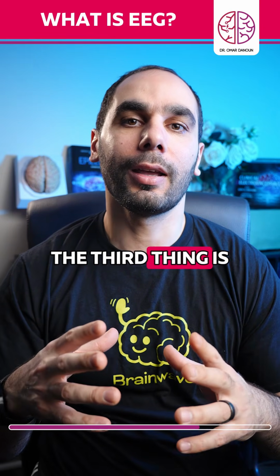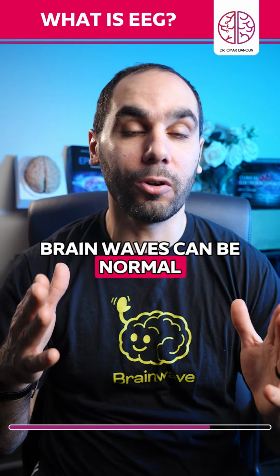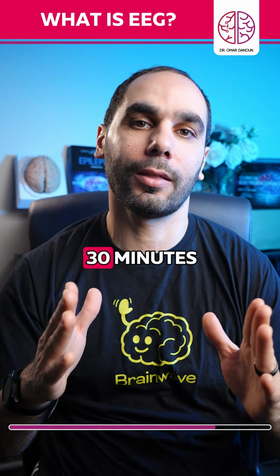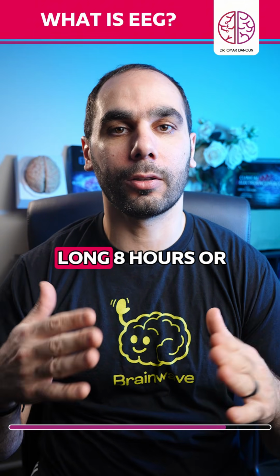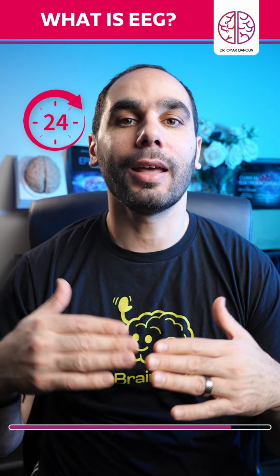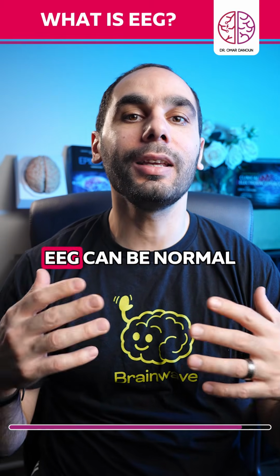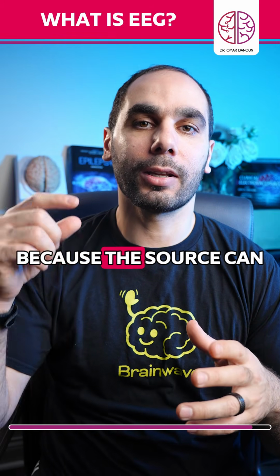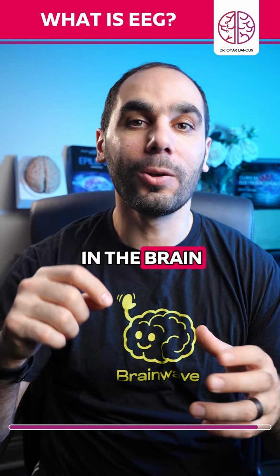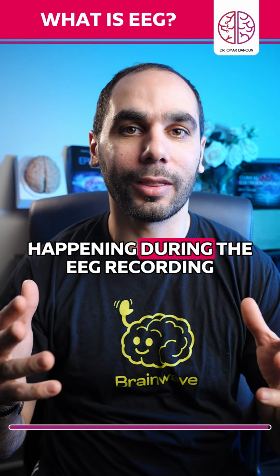And the third thing is that the length of the EEG is very, very important. Sometimes the brain waves can be normal in patients with epilepsy if the recording is like 30 minutes. So if you repeat the test multiple times, or if you do a long 8 hours or 24 hours, that increases the chances of capturing anything abnormal. And yes, EEG can be normal and somebody has epilepsy, because the source can be small or deep in the brain, or it can be just as simple as the discharge does not happen during the EEG recording.